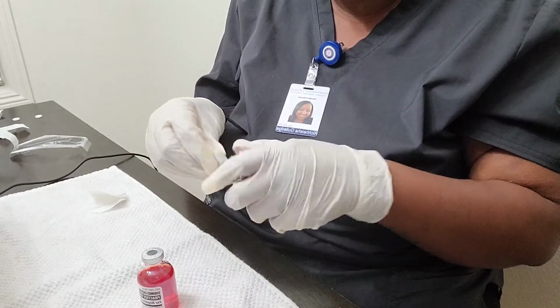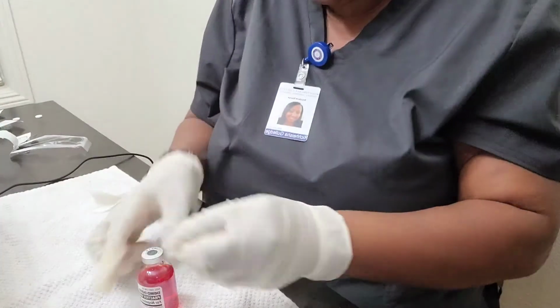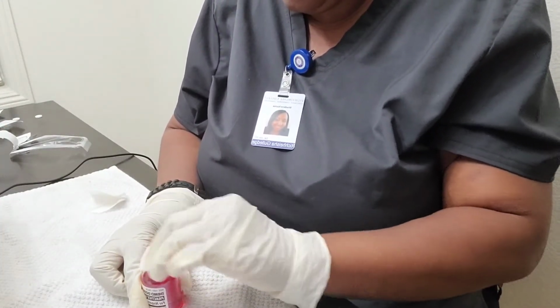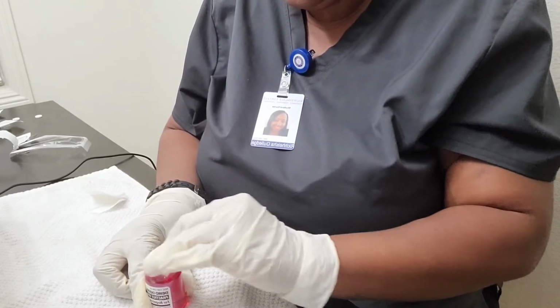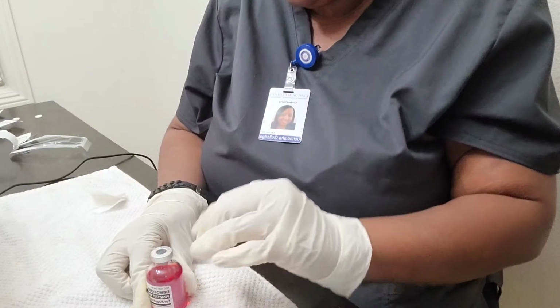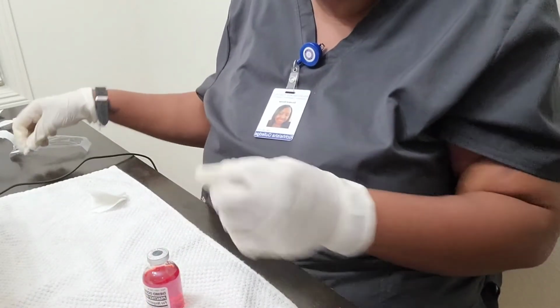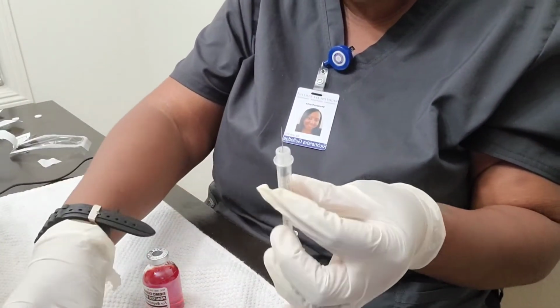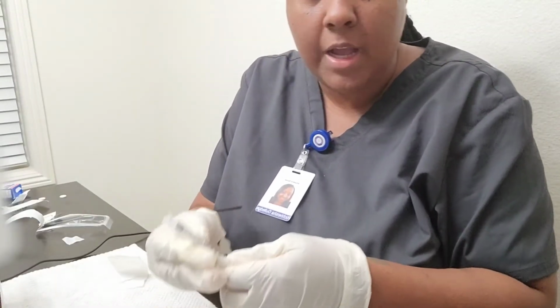Okay, and I'm going to go ahead and clean it. Oops. Trash. I'll go ahead and take the lid off my needle.